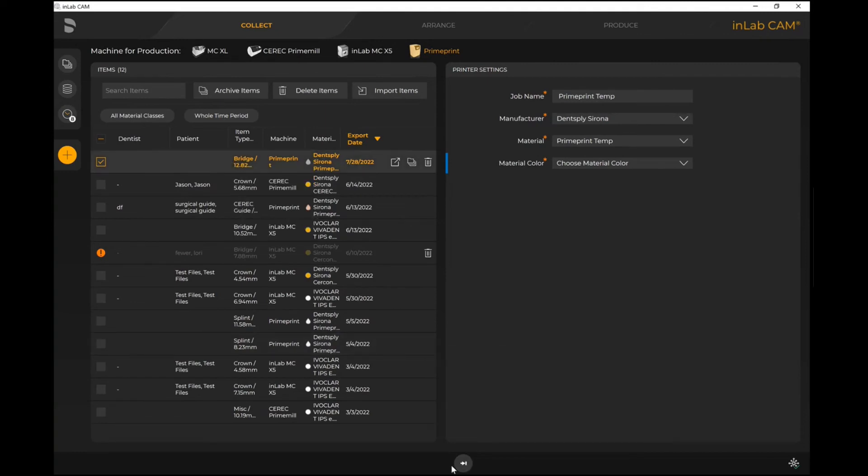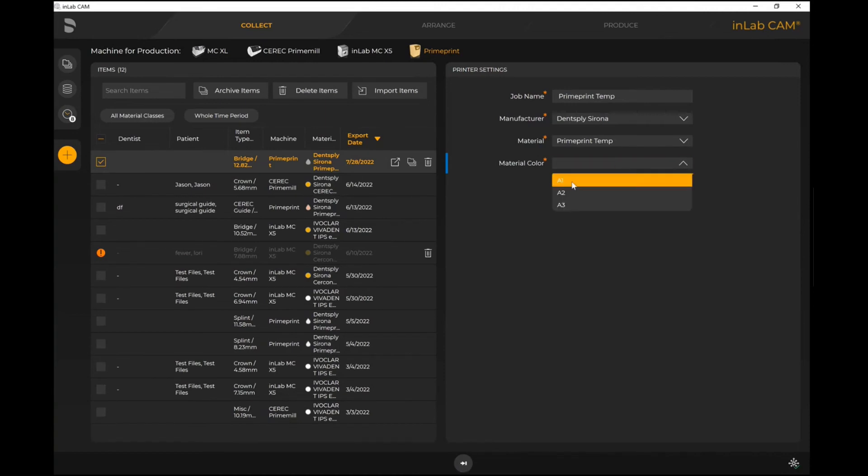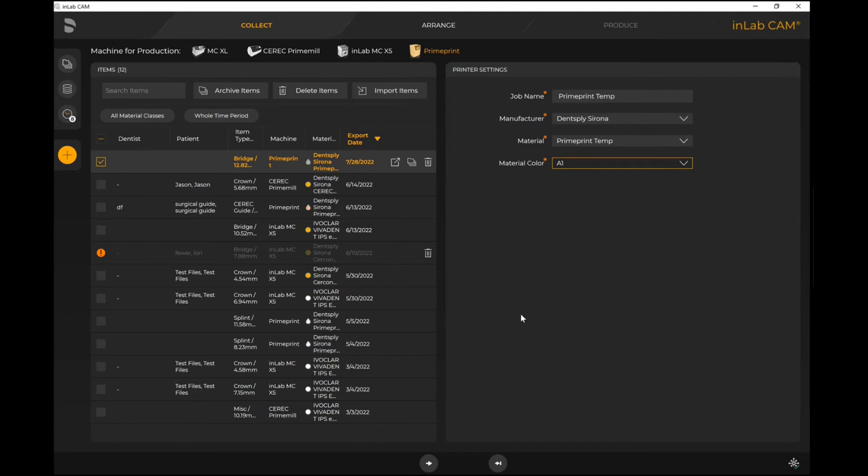You'll see that the Fast Forward tool has become available. I'm able to identify if I want to select the color. Let's say I want to use A1 for this particular case. I'm able to either manually move forward, in which case I can manually control where the supports are going to go and things like that.